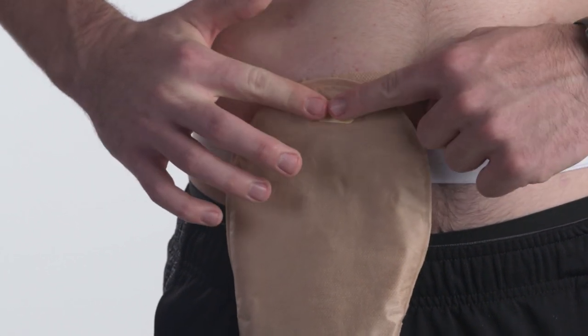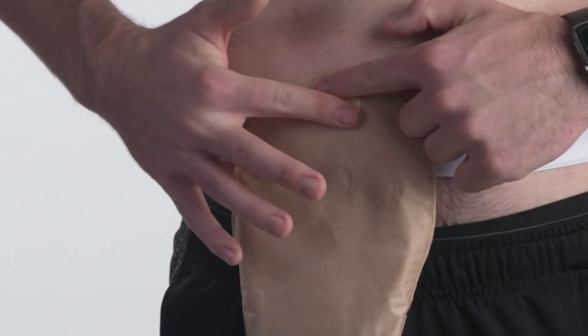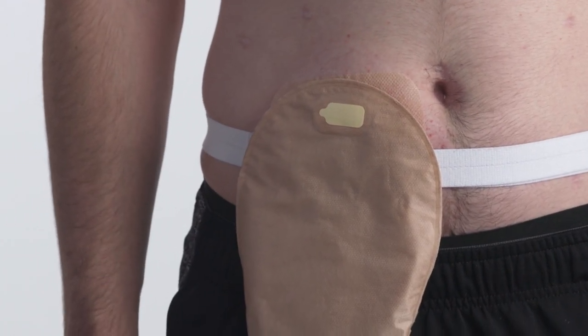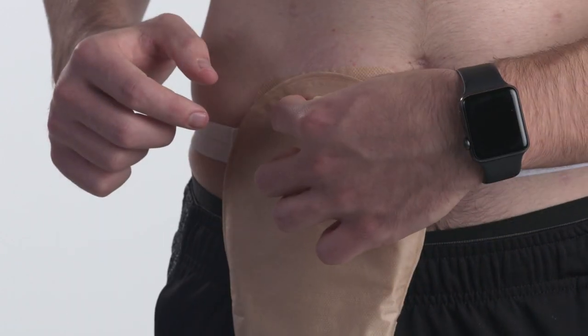Using your finger, rub the sticker to create a tight seal to ensure water does not enter your pouch. After activities are completed and the pouch is dry, remove the filter cover.